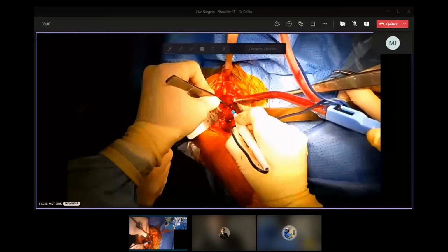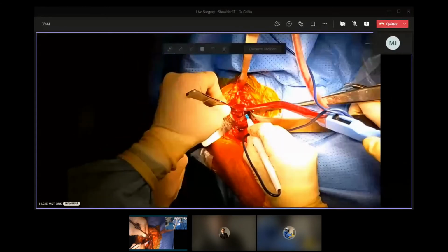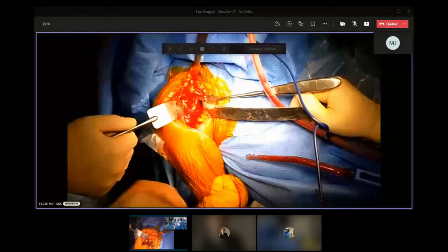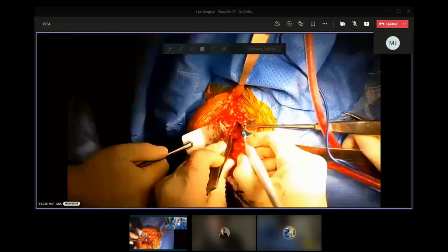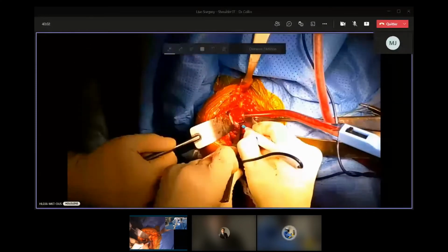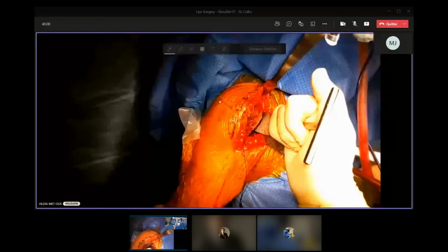This is the key point. You need to spend some time here. If you want to have a nice glenoid exposure, you will see later at the other step that most of the time we have a correct one. You need to finish here. You stay very close to the bone. You finish your inferior capsulotomy. Okay? At this step now, you are allowed to dislocate.